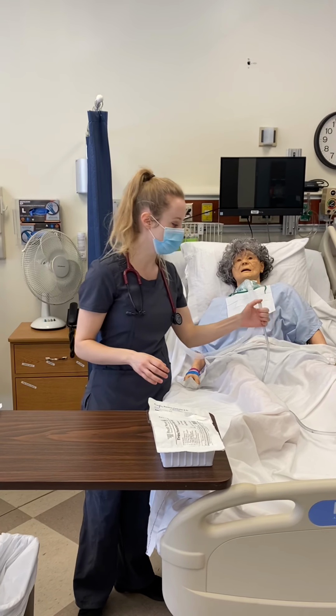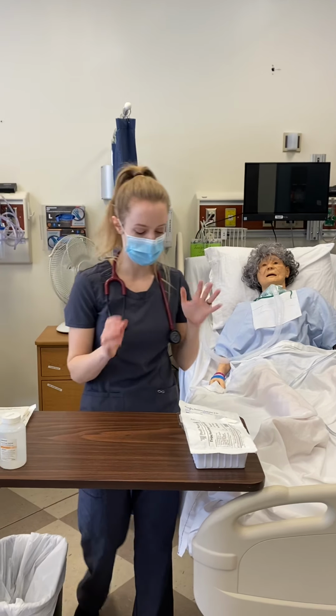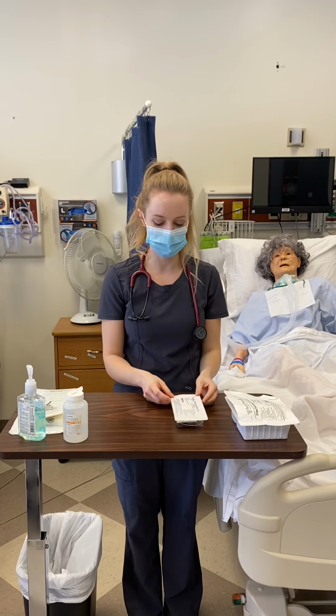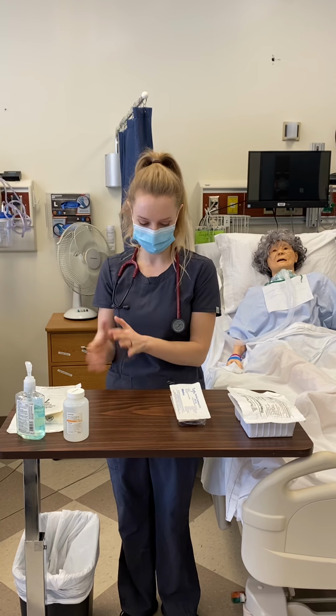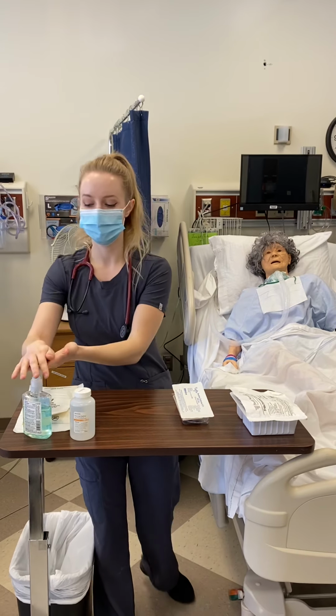I want to test my suctioning to make sure that it works and have my supplies ready. I have my suction catheter. I have an 8 French. In there is a container for my lubricant. I also have some sterile gloves here.